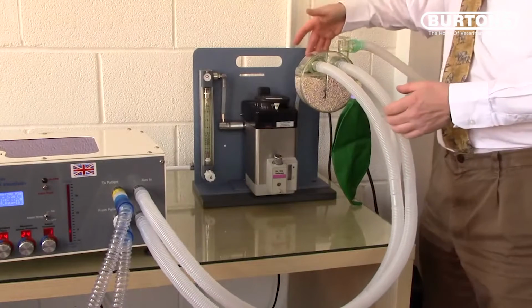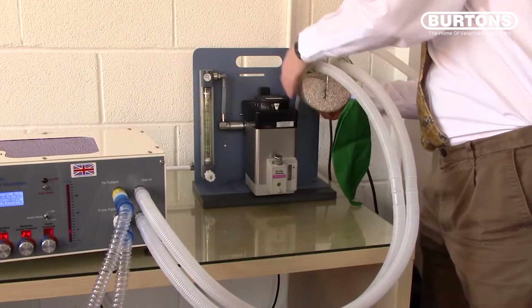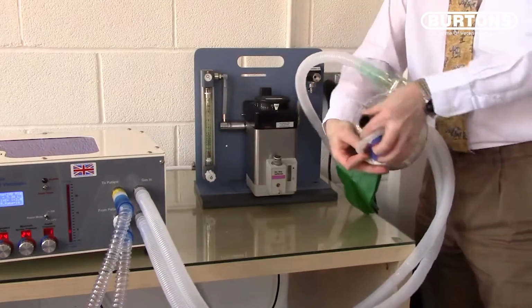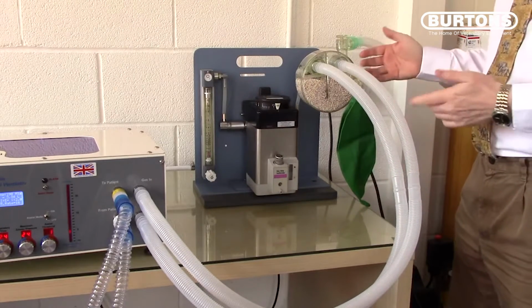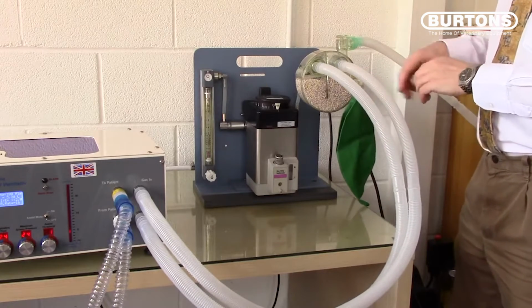What we have here is a fairly typical circle system, which is fed by a single flow from the fresh gas outlet into the back of the circle from the 22mm FGF outlet. In this configuration there must be a reservoir bag on the inspiratory limb to take up incoming gases.